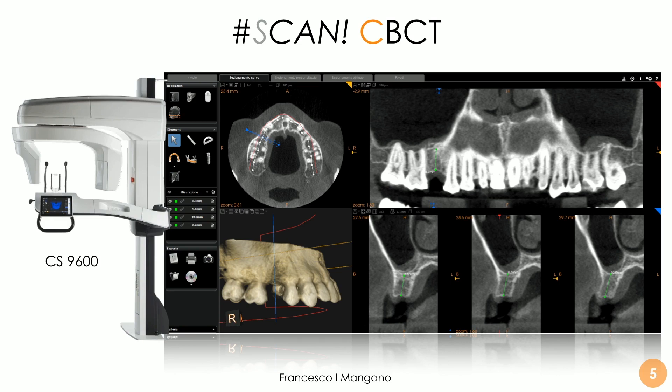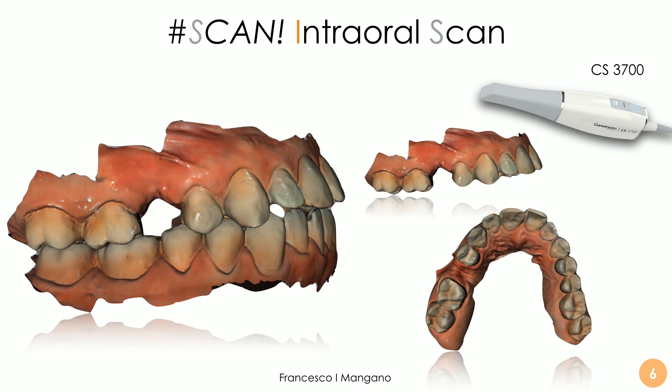Here are some examples of how we work with the SMOP Swiss MEDA software. First, the scan is performed with the CS9600 from CareStream Dental. We use the acquisition software to pre-screen and evaluate the amount of bone available — thickness, bone height, bone volume — to evaluate whether the site can receive a dental implant. Then we perform the intraoral scan with the CS3700 or CS3600. We published an article together with Professor Olga Markina from the Second University of Moscow about these surgical techniques.